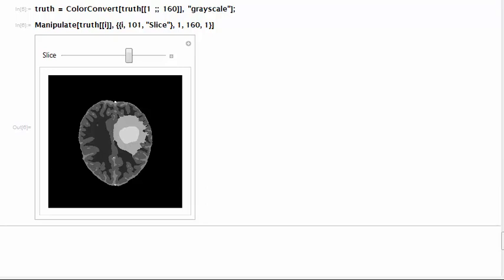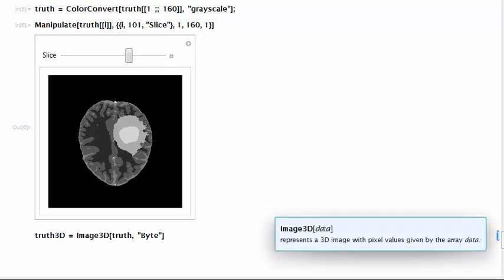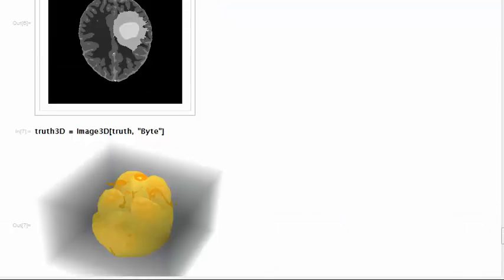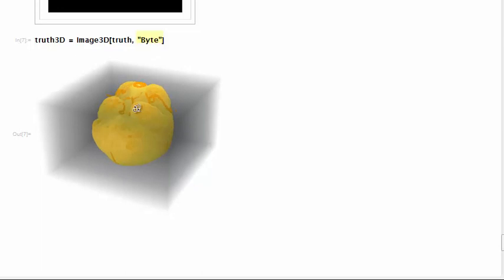To create a 3D brain we pass the truth volume slices to Image3D. We specify a byte data type to save memory because once again we are not doing advanced color processing. The shape of the tumor is well preserved in this dataset while using a byte type.